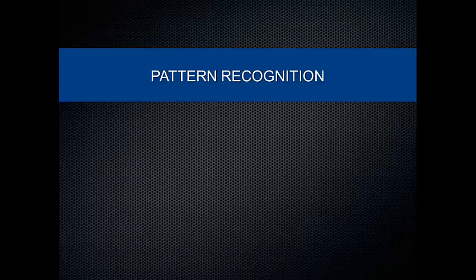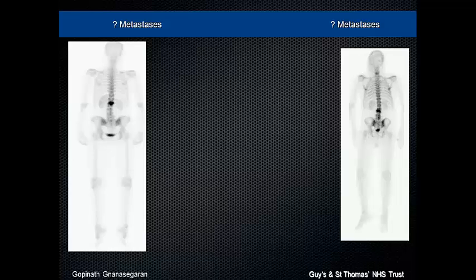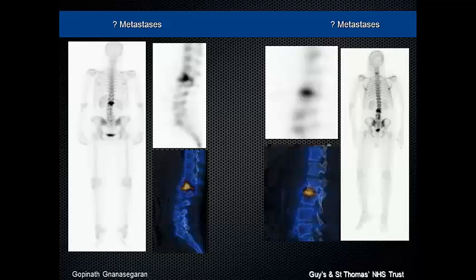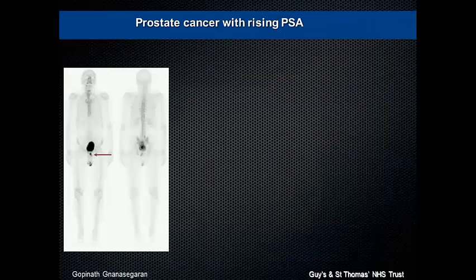So the combination helped us to detect something which has the potential, or is definitely going to fracture if you don't intervene. Pattern recognition. As imaging specialists, we believe in pattern recognition. Two patients with cancer, more or less looking similar. How many will go for metastasis on this first one? If this one, bone metastasis or benign? How many will go for benign? How many will go for metastasis? In this case, the first one, there is a big lytic lesion with a sclerotic margin. That was bone metastasis, and the other was just end plate degenerative disease. So you will have a definitive diagnosis, from equivocal to definitive benign or malignant, by adding the CT component to your SPECT technology.